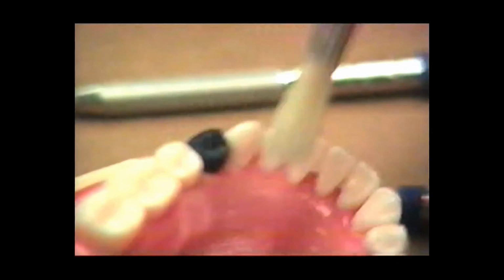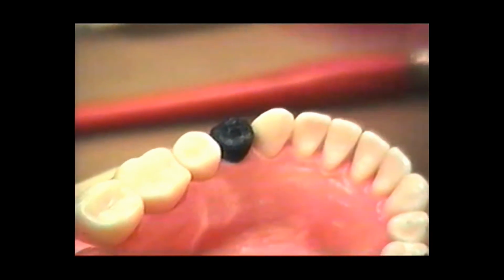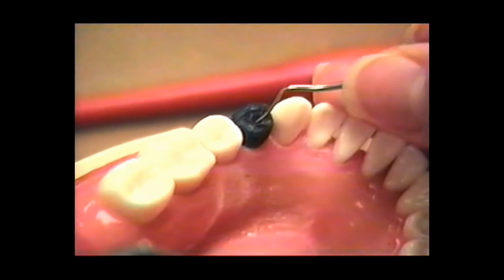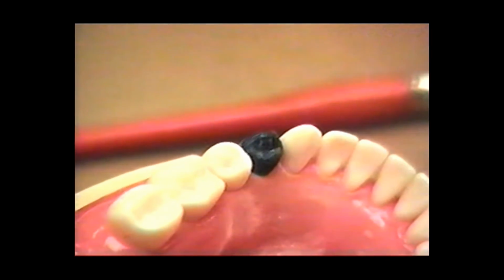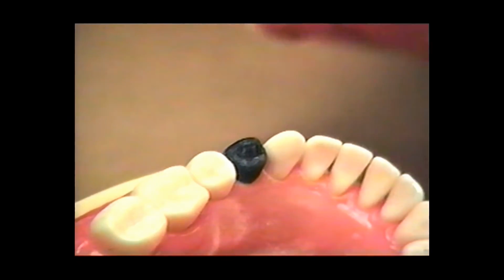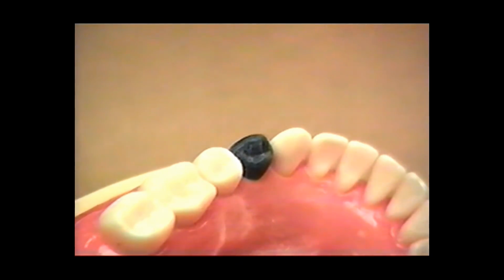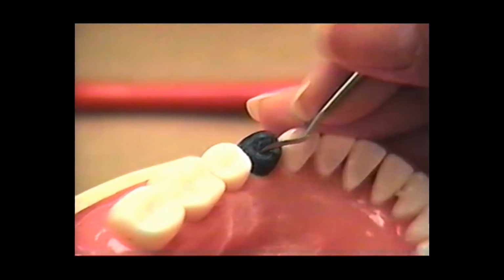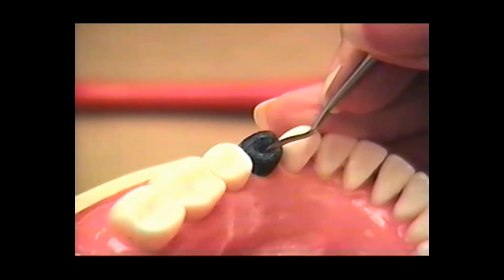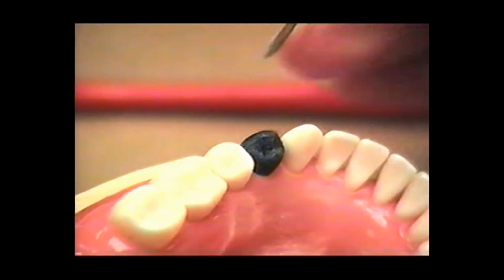The best way to clean this occlusal surface is to have carved it cleanly, and then you don't have to do a lot of work with it. You can take your very clean carving instrument and just go through the grooves and clean it. If you're really brave, you can go to the sink, and with the soft end of your brush, under cold water, scrub right in there, and it gives us a really nice polish. However, the problem with doing that is the wax, as we know, changes a lot with temperature, and the possibility is that you're going to reduce the wax, shrink it, and your occlusal contacts may change. So you have to be pretty brave to do that.